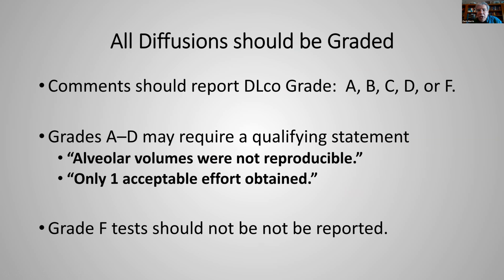All diffusions should be graded A, B, C, D, or F. Now, just like spirometry, we found, and I don't know if they're still doing this, but I sure hope they are, because when I did the analysis of all the satellites downtown, we found that only 70% of our diffusion efforts were meeting grade A or B criteria. Okay, 30% were not. The guidelines say you should be achieving grade A in greater than 90% of your tests, okay.